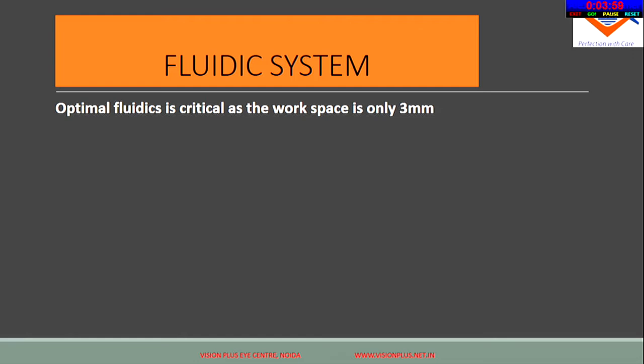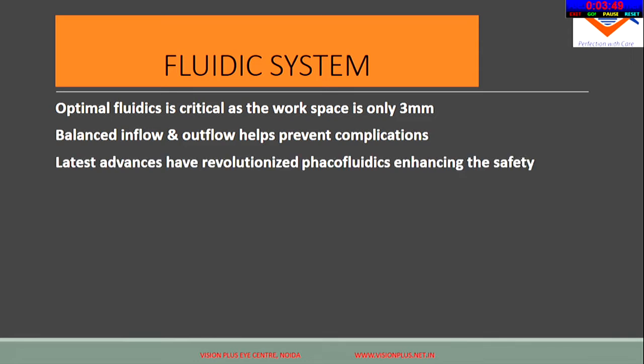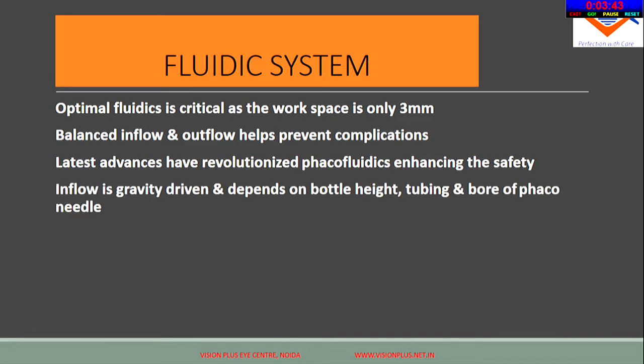The fluidics system is again something that we need to look into, because optimal fluidics is very critical. We have a small space in which we are working, and the balance on the inflow and outflow is what prevents the complication, maintains the chamber stability. And different machines have revolutionized the PHACO fluidics and have made the procedure much more safe.